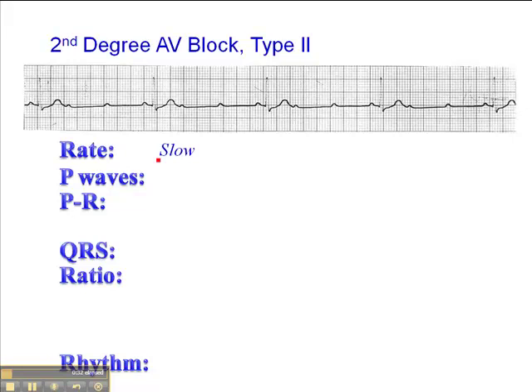If we look at the heart rate for this one, we find this QRS falls fairly close to a dark line. So the heart rate here is 300, 150, 100, 75, 60, 50, 43, 37, 33. Because this one falls just inside a line, as does this one, probably a rate of about 36 beats per minute in this case.